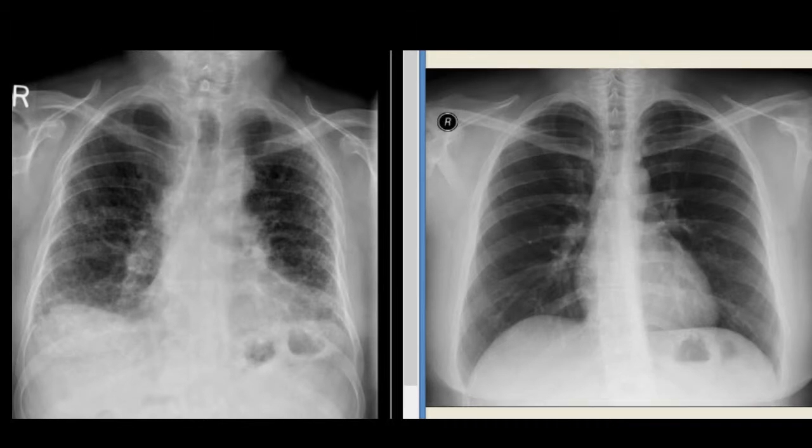The chest X-ray on your left hand side is an AP view. You can immediately notice decreased lung volumes on both sides, but it is more intense on the left side. The trachea is not only dilated but is also slightly shifted towards the left side, as if something is pulling it toward the left.